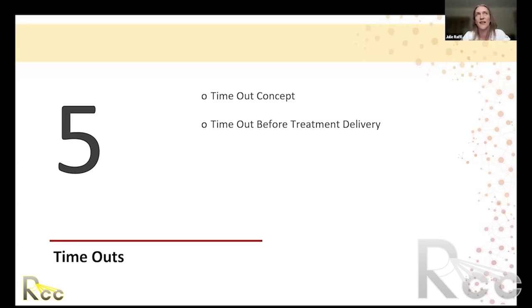But if we're applying a shift one day and then we're not re-imaging the next day, you want to be very careful about making sure that that shift was appropriate and that you're always being consistent. If you're doing a weekly image and you're just imaging once a week and you notice that you're shifting by 1 cm, you probably want to repeat that image the next day to make sure that that correction is consistent from day to day.